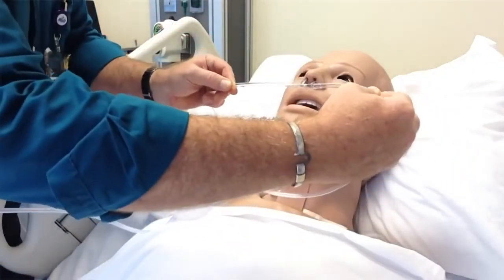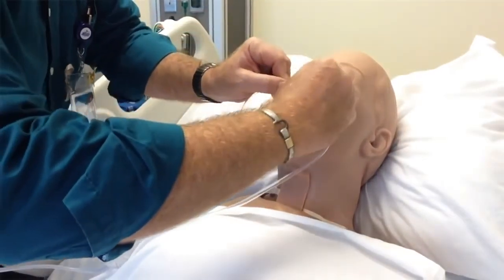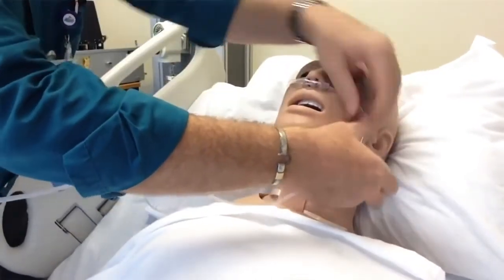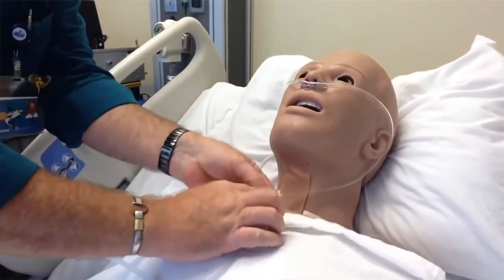Now, when we use oxygen outside of a hospital setting, at home, or as we discussed in a RWA designated area, the oxygen can be delivered by nasal cannula or by a face mask. Typically we would start with a nasal cannula, which is a simple tubing with 2 ports which are placed inside your nostril. After placing them in your nostril, on either side the tube hooks around your ears, and then you can tighten it so that it is secure.